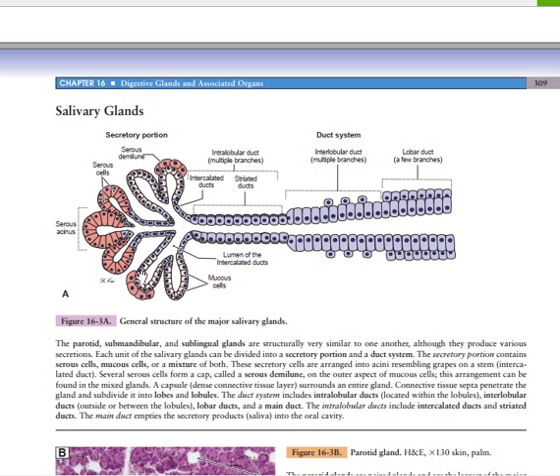So this one is a mixed gland because it has both mucous cells, which have clear cytoplasm, and demilune cells with pinkish cytoplasm and granules. Is it clear? So these are mucous cells here, which are clearer. Now this is the duct of the cells here. Now the duct of the cells is this small duct here.